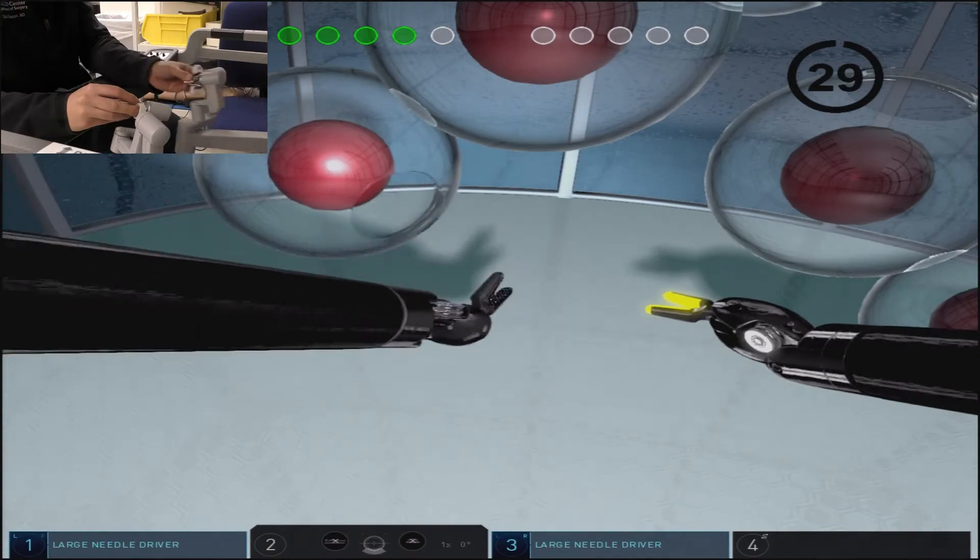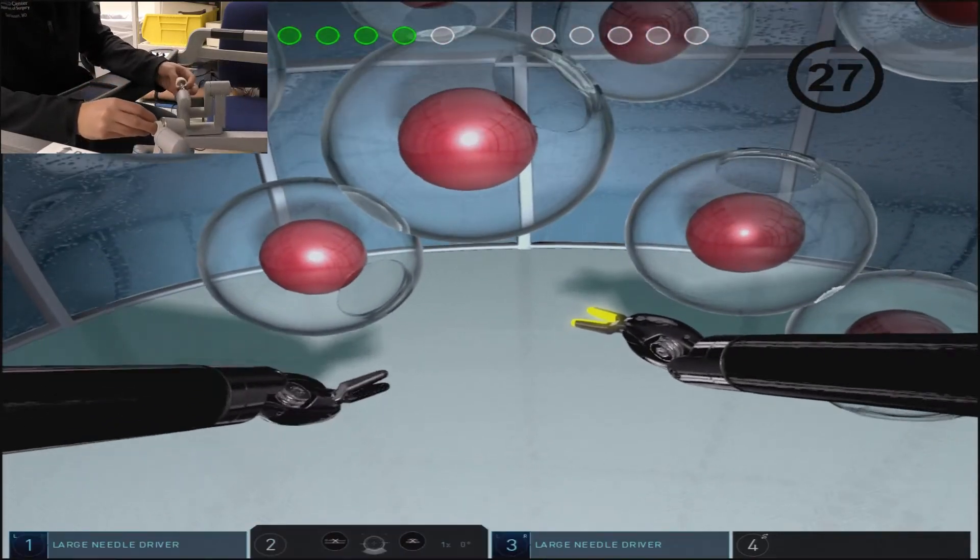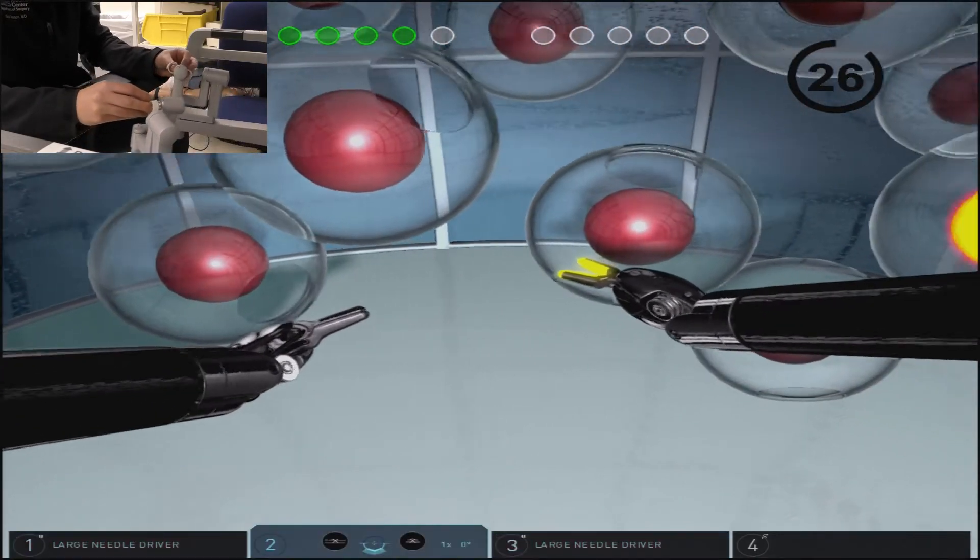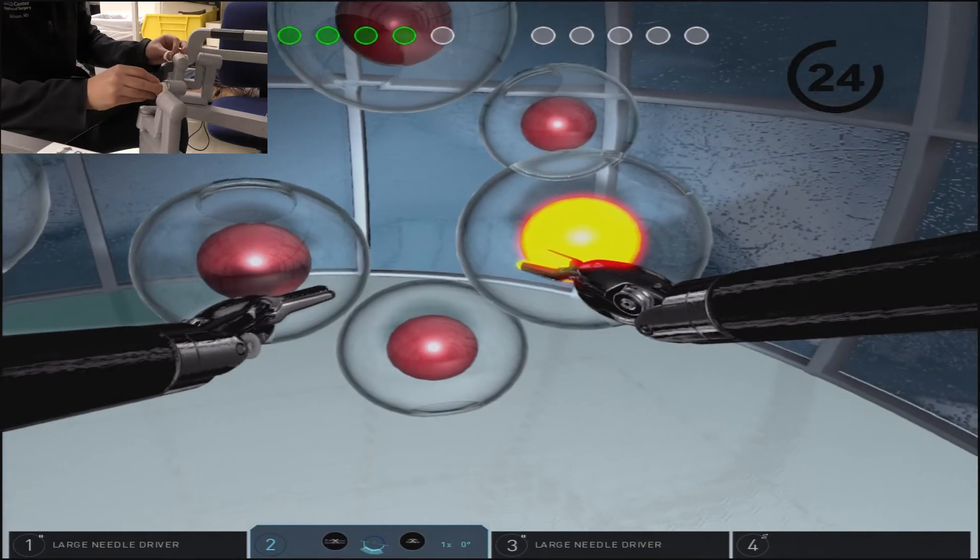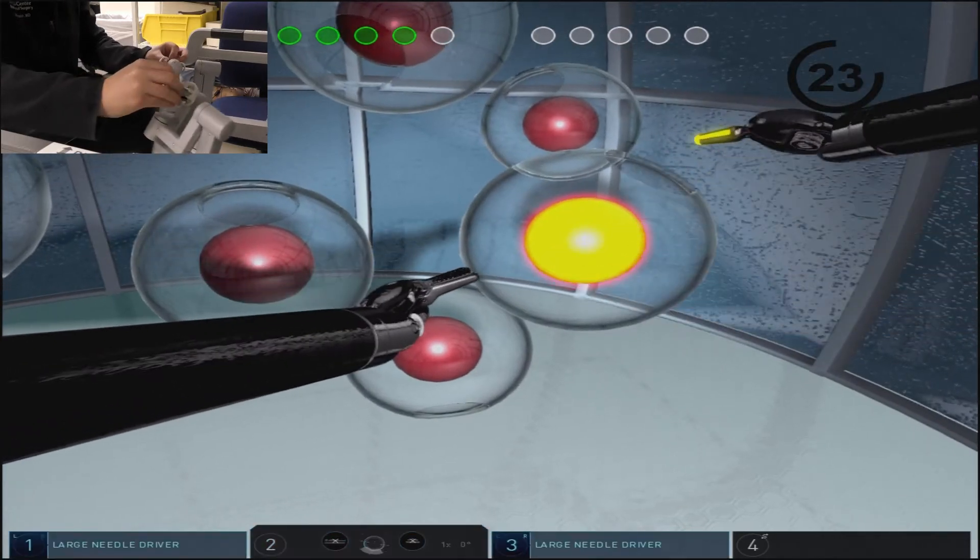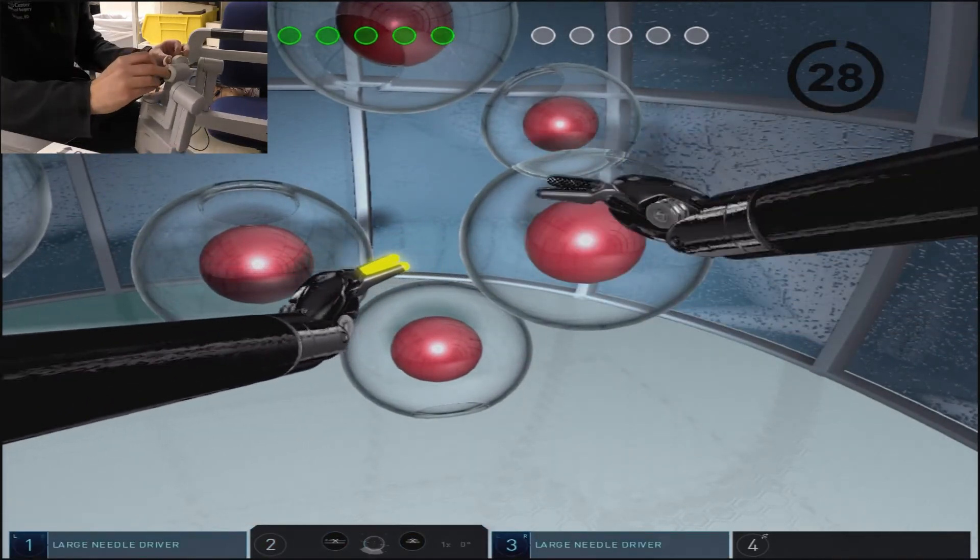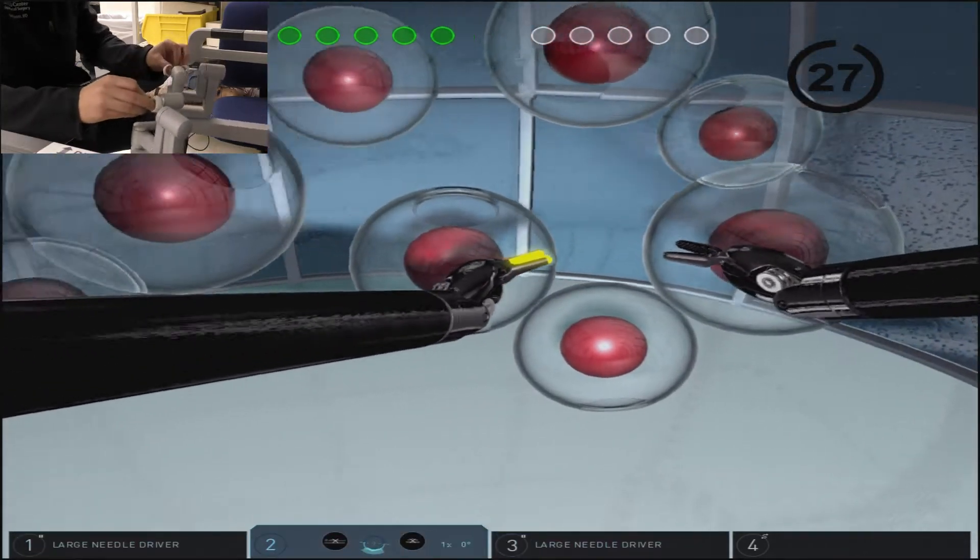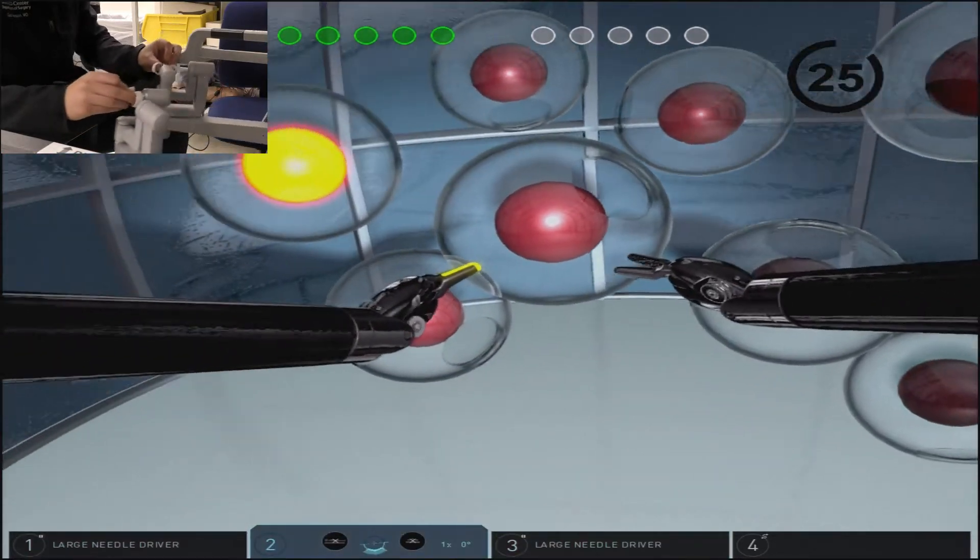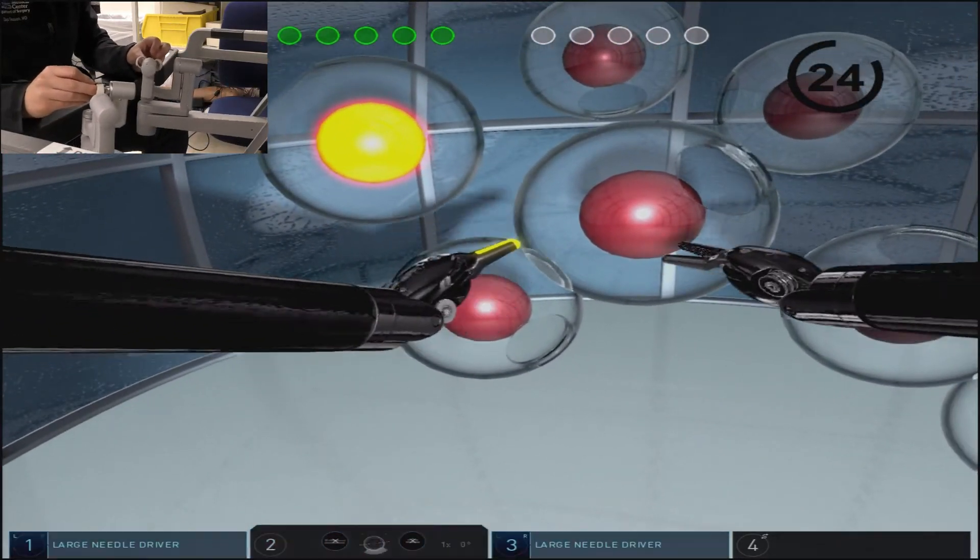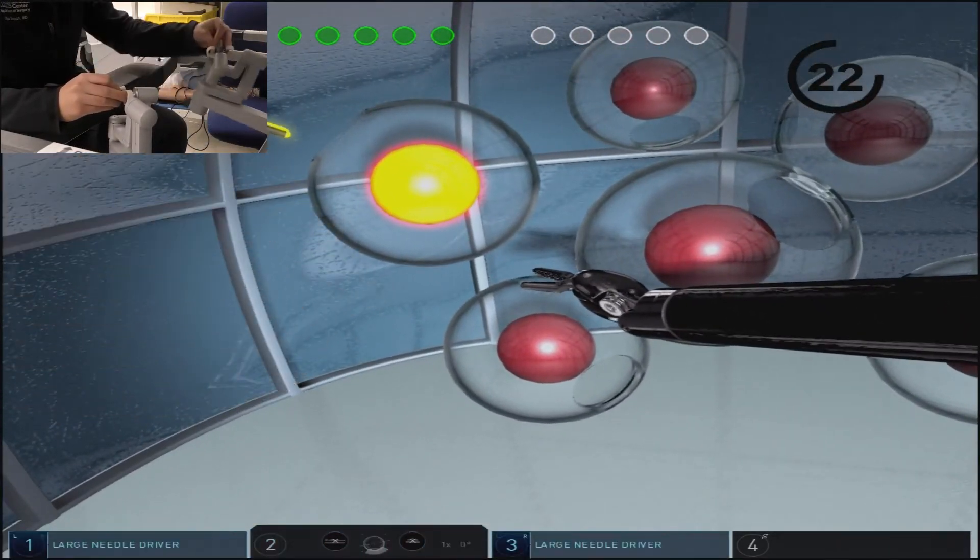Camera utilization is important in this exercise to provide the appropriate view of the opening in the glass globe and thus allows you to minimize penalties in regards to touching the globe or applying unnecessary pressure.